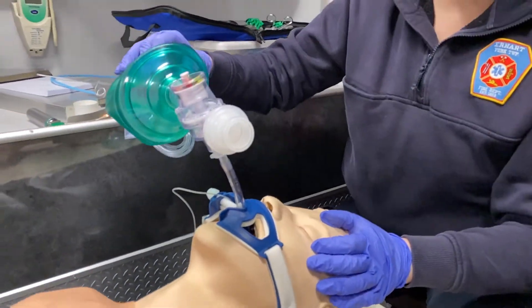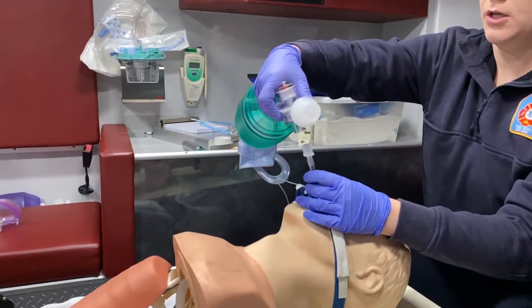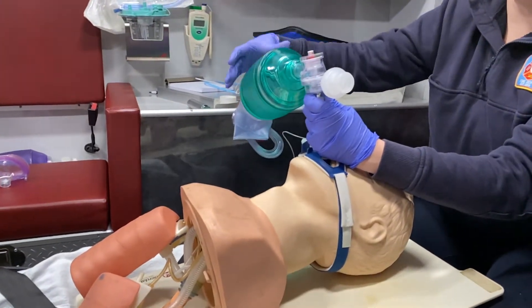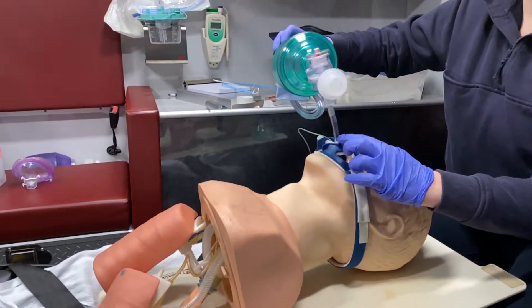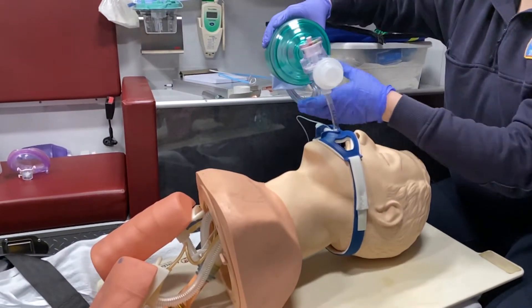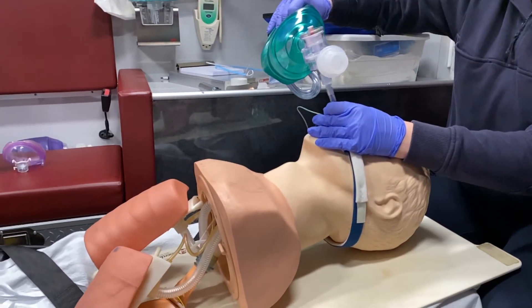Some other ways to confirm tube placement include using waveform capnography — the connector piece goes between your BVM and your ET tube and plugs into your monitor, just like the nasal cannula capnographer. We could also look for condensation in the tube when the patient exhales. You want to bag this patient once every six seconds, so make sure you're counting out loud so you're not over-bagging and over-inflating their lungs.